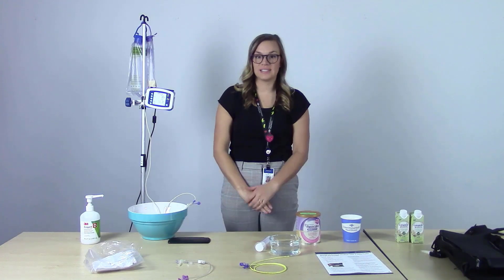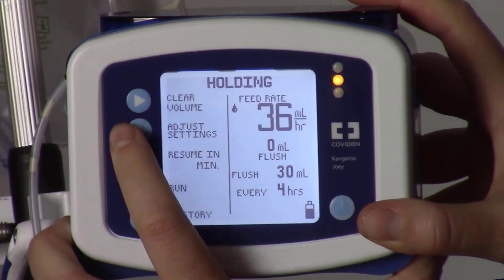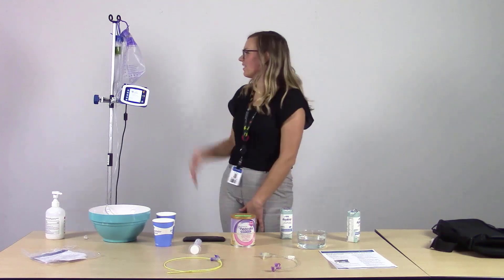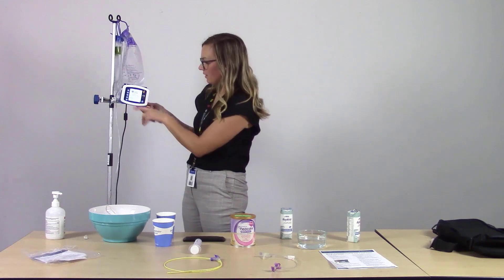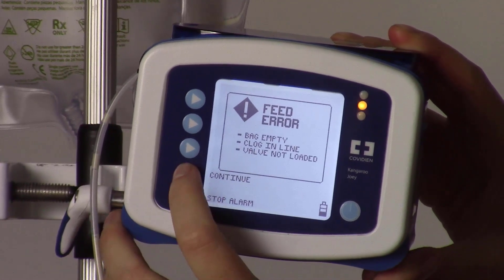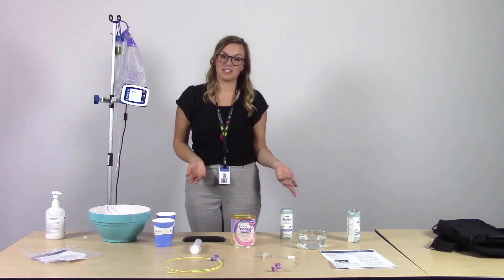When you're done with the feeding or need to stop for any reason, select the hold button. When the formula has run out and the bag is now empty, the pump will alarm 'feed error.' It gives you the options bag empty, clog in line, or valve not loaded. We've finished one segment of the feeding but still have an additional carton to give to the patient later today.